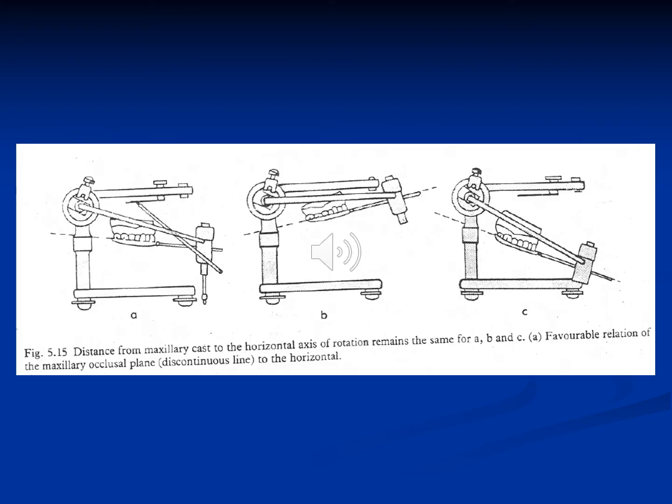Now, how the maxillary arch is going to be mounted on the articulator using the face bow. Of course, it can move up or down freely and still be related accurately to the center of rotation. However, this is not convenient because we want it to be related in a more anatomical way, and that is why we use a third point reference. As can be seen in A, there is a stylus that is related to an arc on the articulator, and that is a third point reference. Usually that stylus is directed to the infraorbital foramen or inferior rim of the orbit, but in the face bow that you are going to use in the laboratory, there is a nasion rest. There is a piece that rests on the nose, and that will fix the face bow in an upward, downward direction, and will be our third point reference that will determine how the upper model is going to be placed in relation to the upper member of the articulator.